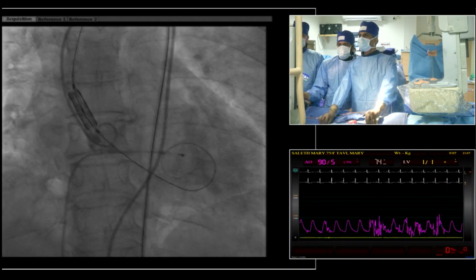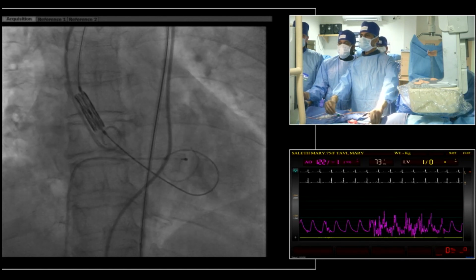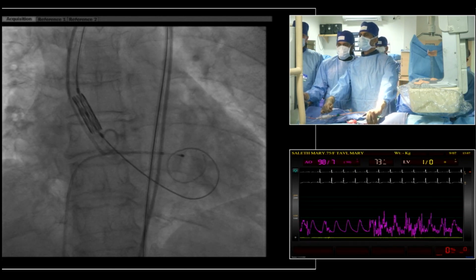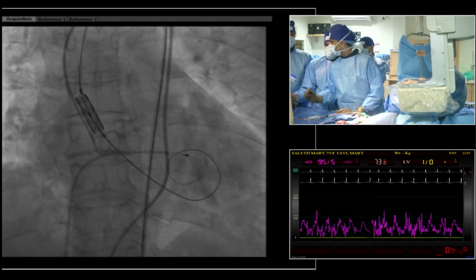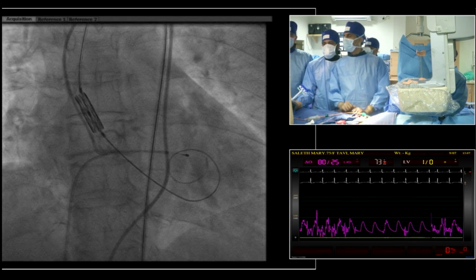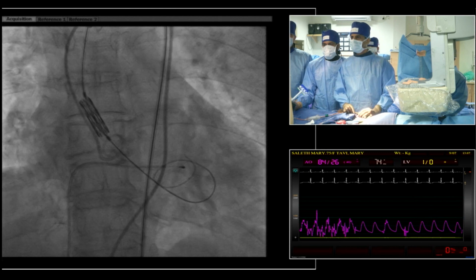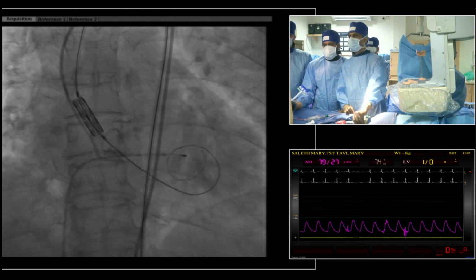You just see the pigtail is too much proximal. There is possible about 4 millimeter or 5 millimeter, which wouldn't go below the level of the pigtail. Yeah, it's okay. What do you think? It should be okay to deploy. So if we cross the valve now, we'll cross when you're ready. Give me a test again, the pigtail. Is it okay?